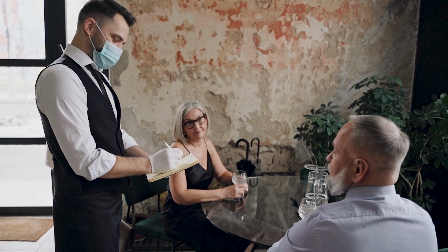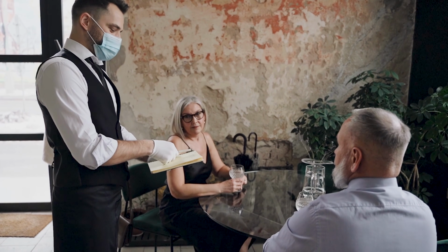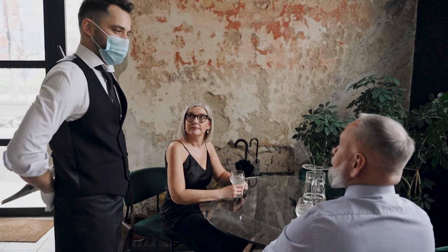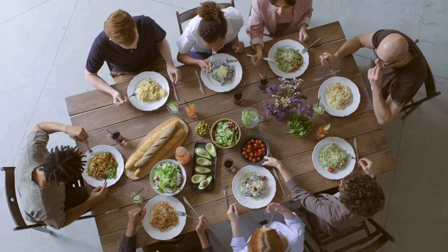In practice, this means that if you're in a restaurant, which is exactly where Oticon state that this 4D sensor technology would shine, depending on your scenario, this technology will react quite differently. For example, a waiter in a restaurant needs to hear sound coming from all directions as they take care of different tables, joining multiple conversations. Whereas if there was someone greeting customers entering the restaurant, their hearing aids would need to work differently, comparing that to someone sat at the table with multiple people. So 3 different scenarios in one location, all in a restaurant, but very different hearing needs.